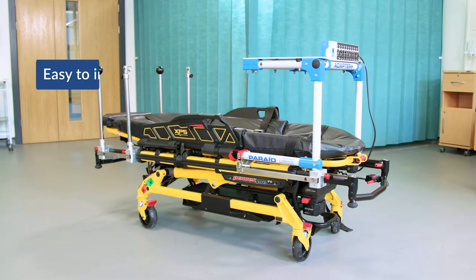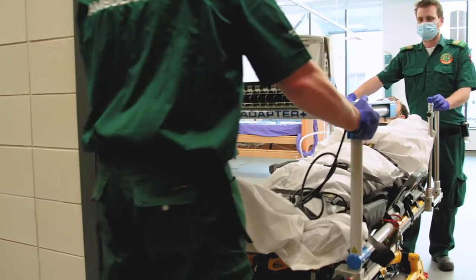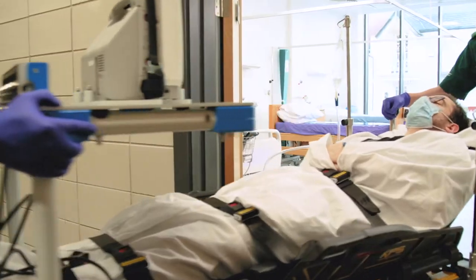The Adapter Plus enables a standard Stryker stretcher to carry critical care equipment. There are four key components to the Adapter Plus.